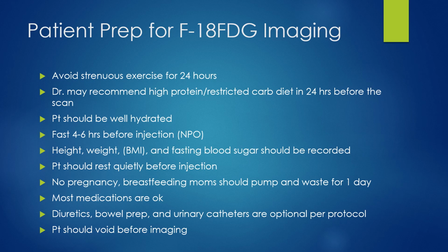No pregnancy. Breastfeeding moms should pump and waste for about a day. The actual FDG decays sooner than a day. It decays in about 12 hours or so. And it isn't really known to go to breast milk anyway, but the FDG is so radioactive and rapidly decaying that you don't really want the baby close to the mom to breastfeed. And so that's why we say pump and waste. And then ideally someone else should give that baby a bottle for the first couple hours after the scan.